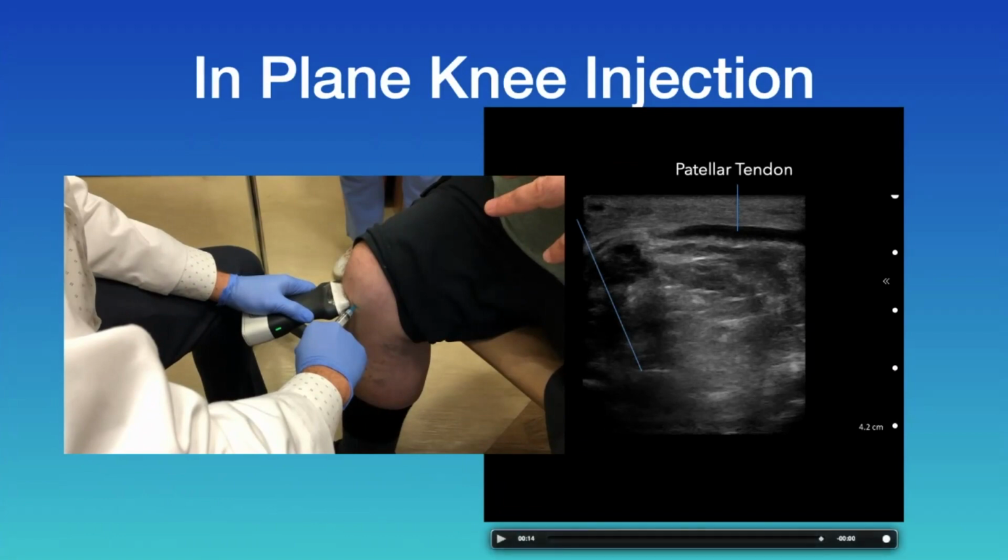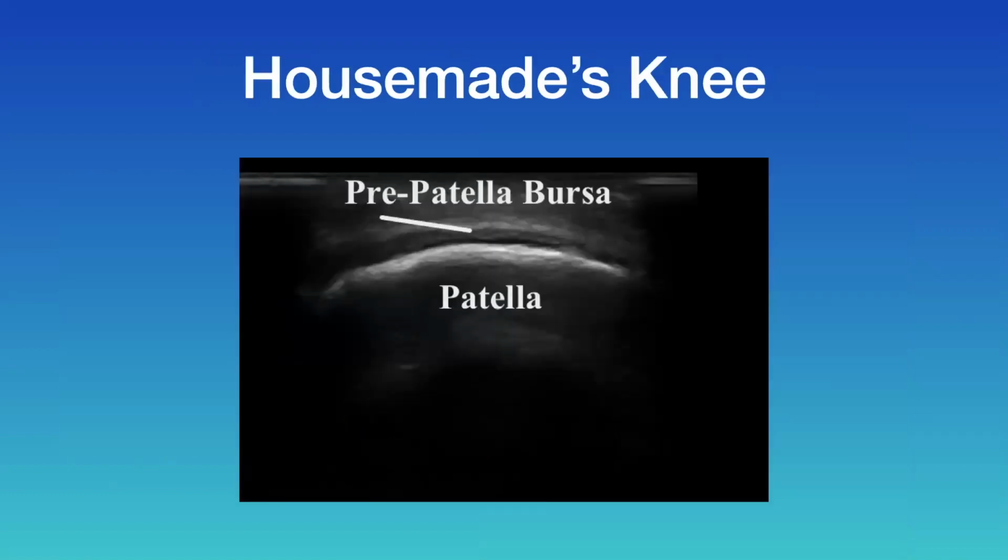Okay. The needle is really behind here. I put this highlight here so you could see where I am better. And the local is going over here. Here's the patellar tendon. And those are the main relevant structures.